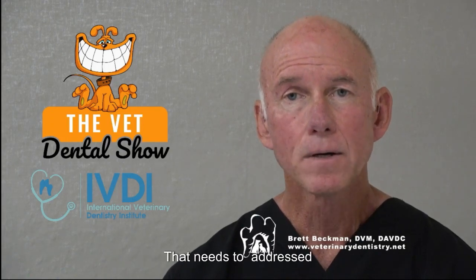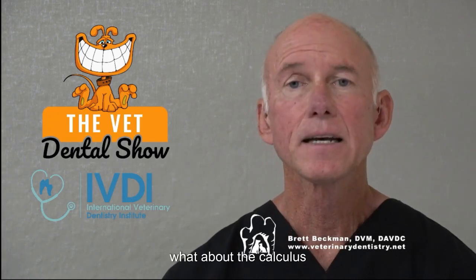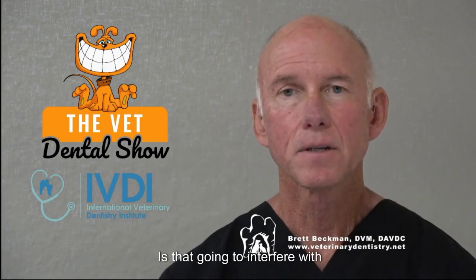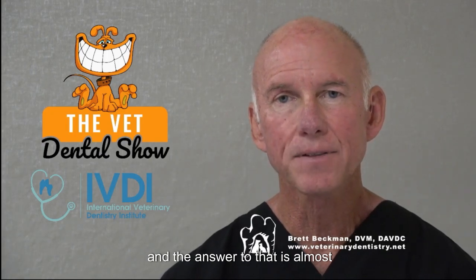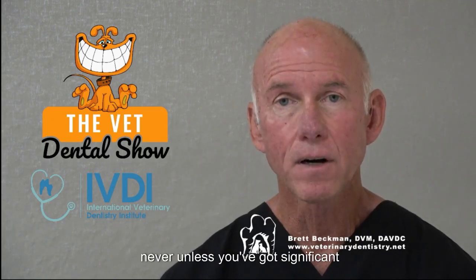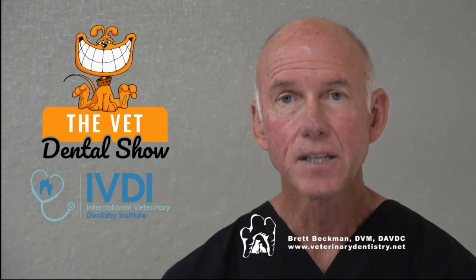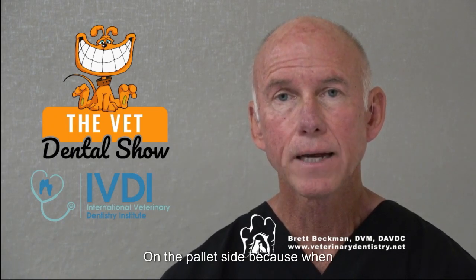Now, one question that arises often that needs to be addressed is, what about the calculus? There's a lot of calculus on those teeth. Is that going to interfere with my radiographs and my interpretation? And the answer to that is almost never. And almost never is pretty much never, unless you've got significant palatal calculus on the palate side.